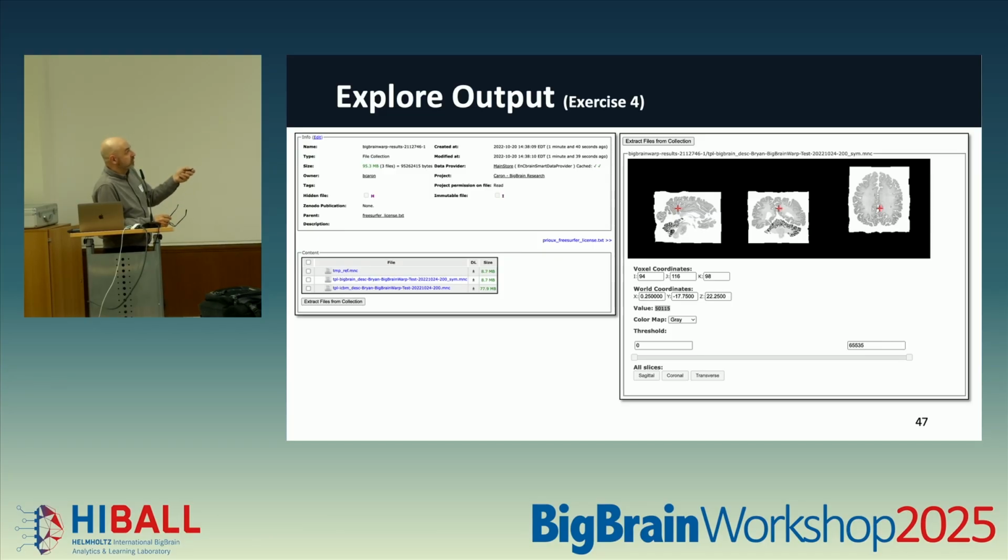And again, the view that you'll have right now is a little different than this one because we now have better options. You can toggle which view you want as well as the resolution of the view.